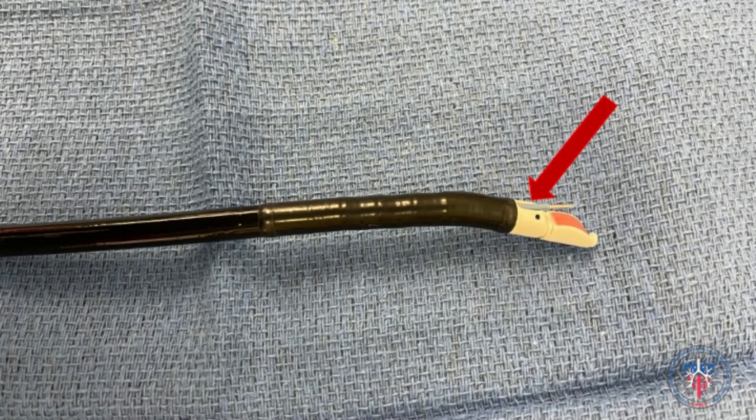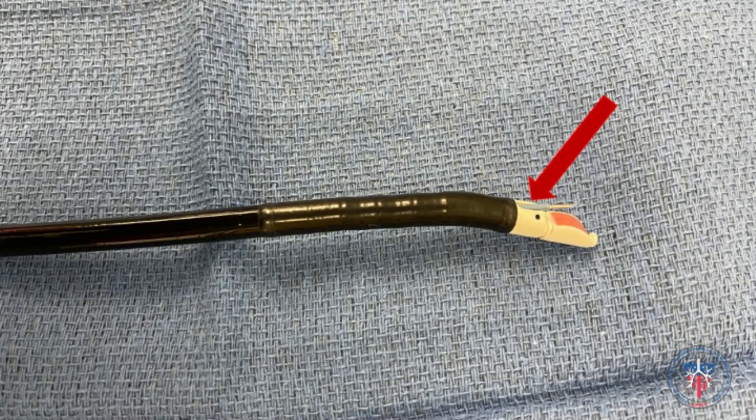The last important piece of the endobronchial ultrasound scope is the working channel. Here you can see a needle extending from the working channel, indicated by the red arrow.